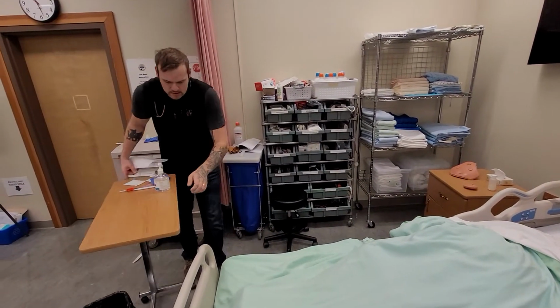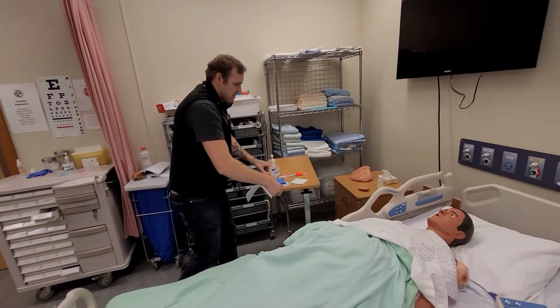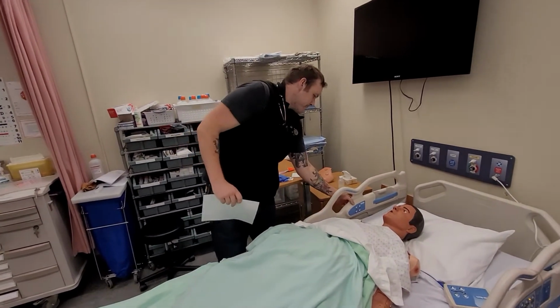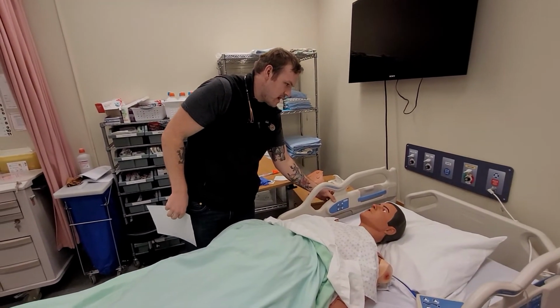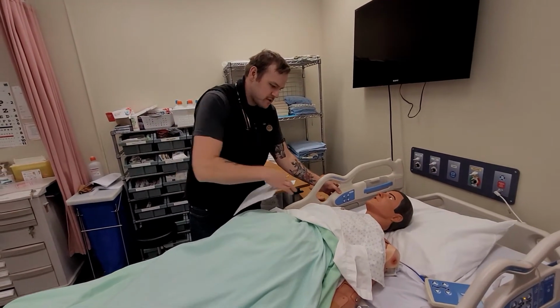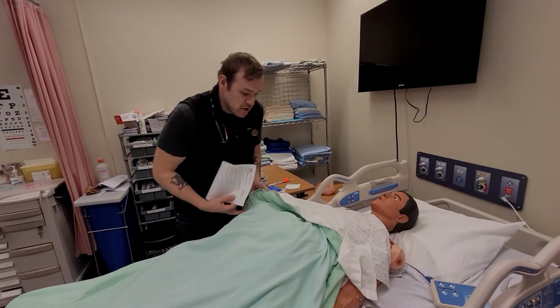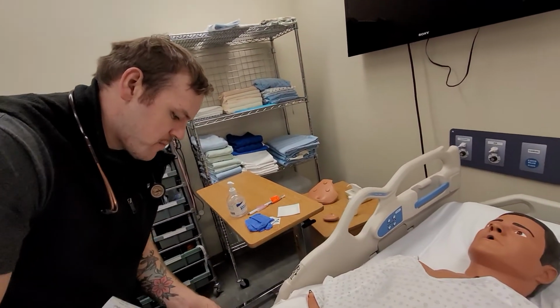Bring my supplies to the bedside. So you're still in a lot of pain. I'm going to assess that pain after I've given you the medication. First things first, we're going to check and make sure it's you. Okay, so we're going to go to your wristband here. Take the MAR right to it.